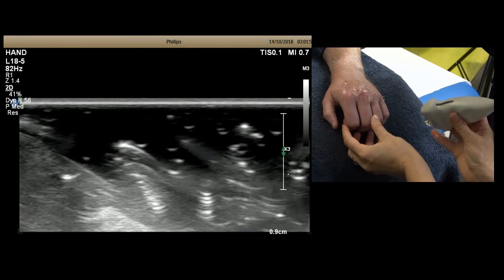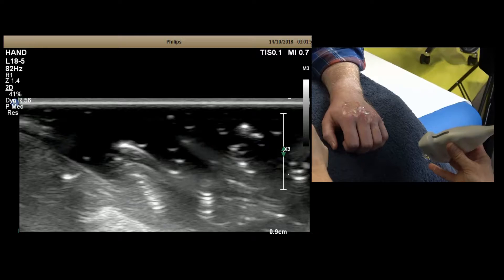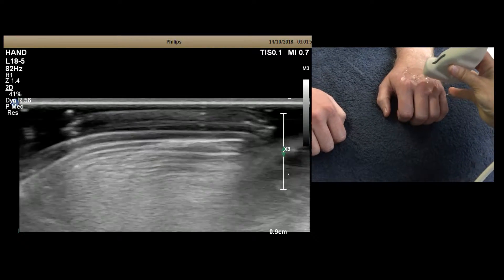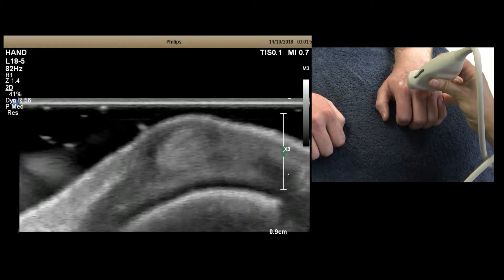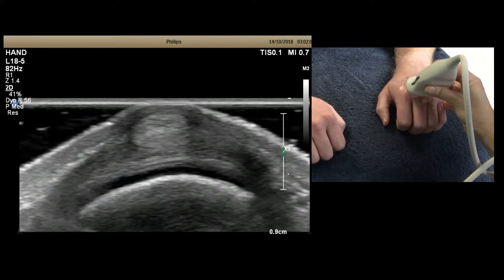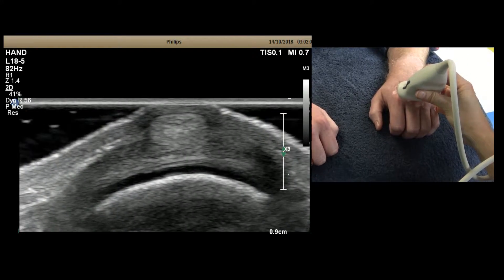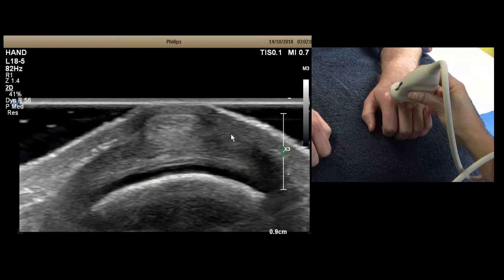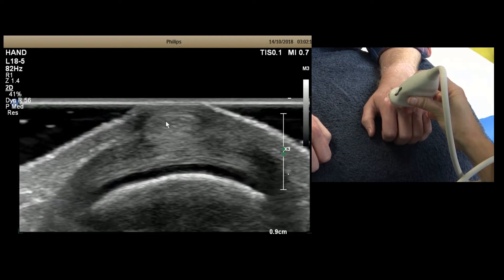For a boxer's knuckle assessment, you want a relaxed fist so that you can ask the patient to squeeze tight and relax — it's a dynamic scan. Starting on the MCP joint, you'll see over the top of the tendon the thinnest little band going up and over, and it's also slinging underneath.